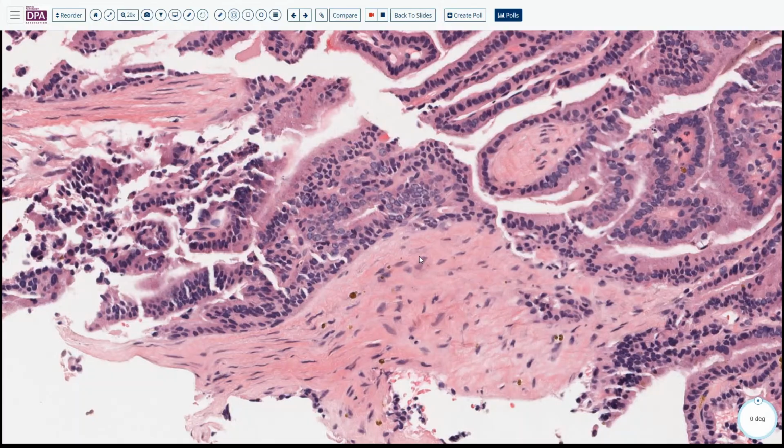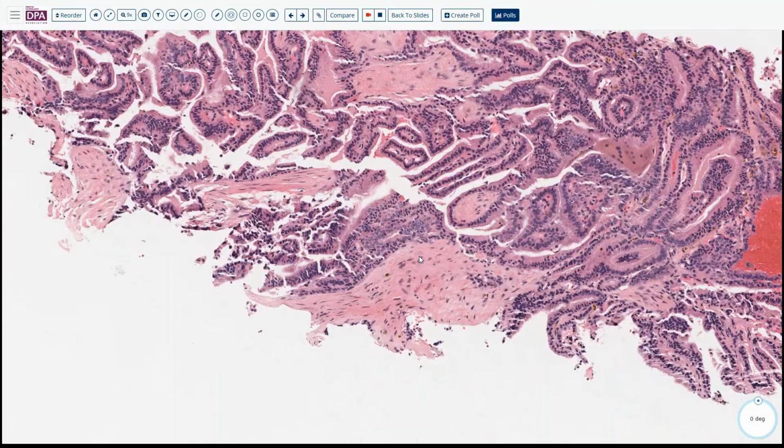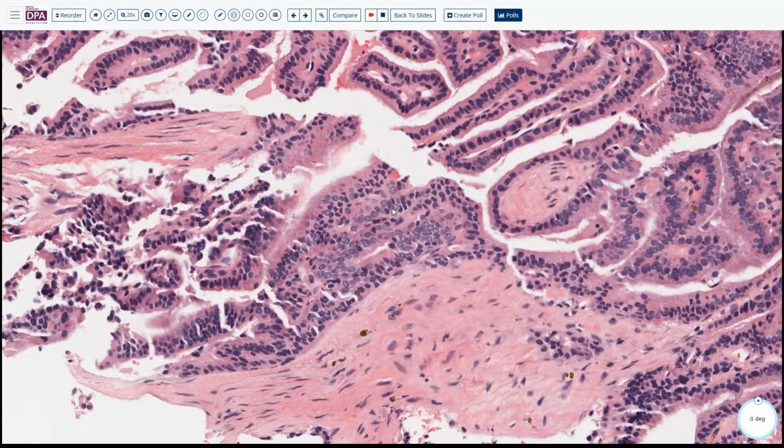Yeah, this is exactly what it is. So you need to keep your mind open when you sign out anything, because papillary structure is not only in the breast, right? We have John mentioned this papillary thyroid carcinoma. Until we find, oh, this chromatin pattern is just like Orphan Annie. So really suspicious. Maybe this power is not that high, just 10x.